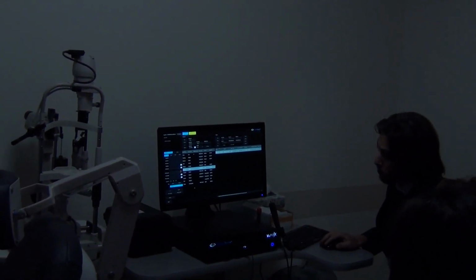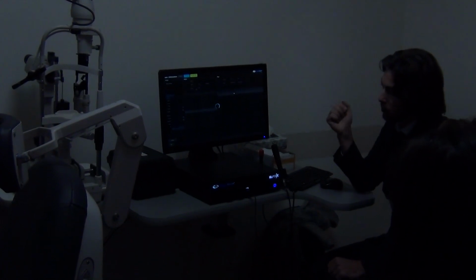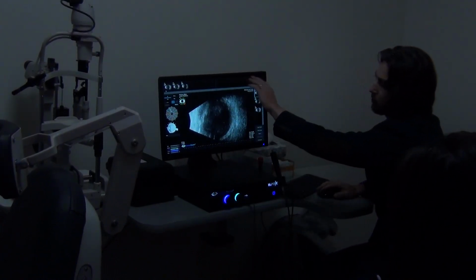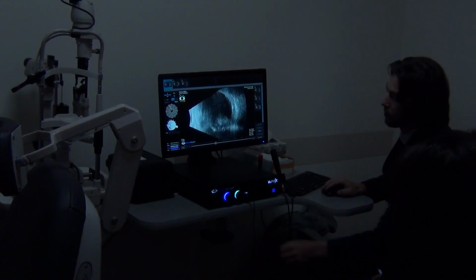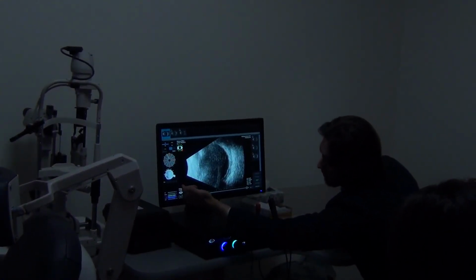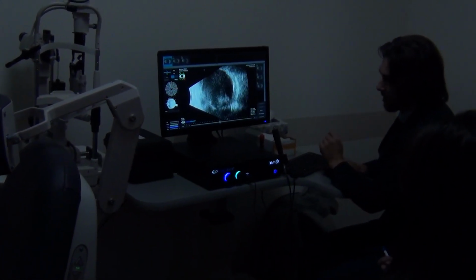If you'd like to review a patient scan, let's say same patient, here is the exam, you just click on view, and it will bring you to the viewing screen where you can do additional studies, right? So you can play those videos, which are on top of the screen, right eye, left eye. You can control gain, brightness, right? We have a baseline logarithmic gain, exponential gain, and time variance gain. So it's all very simple. Doctors are aware of all those features when they perform their specific tests.